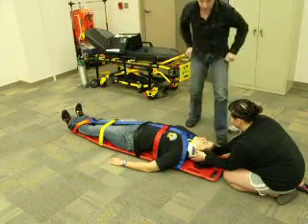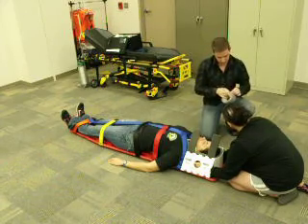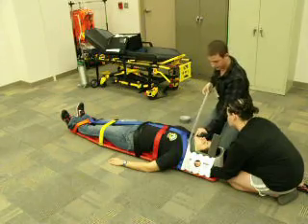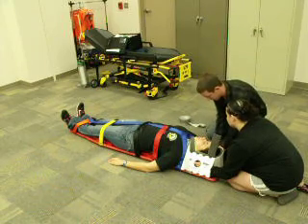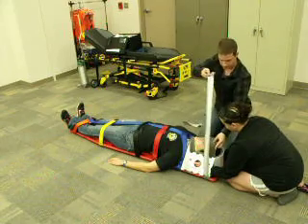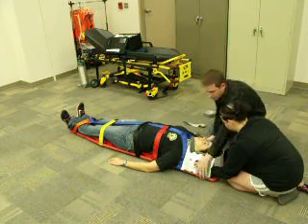At this point in time, I'm going to take over C-spine and my assistant will apply the head blocks.